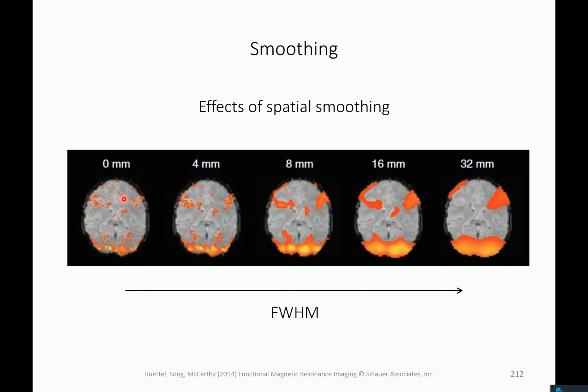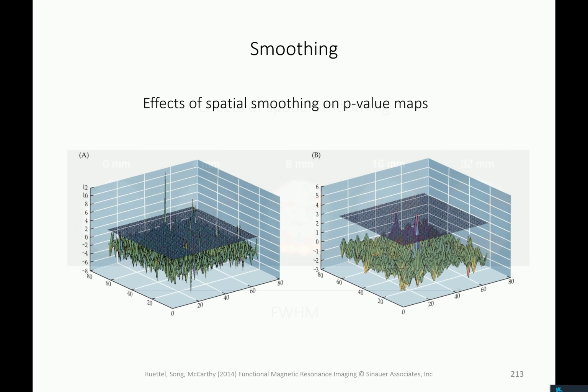So maybe going on there. There is actually a spatial model that also models spatial noise, and this is random field theory, which is a spatial model, and the model of the noise is that it has a specific, namely Gaussian process, and then a statistical random field covariance function. But, like I said, there's a whole semester course to go into that, and we first need to talk about GLM anyway.